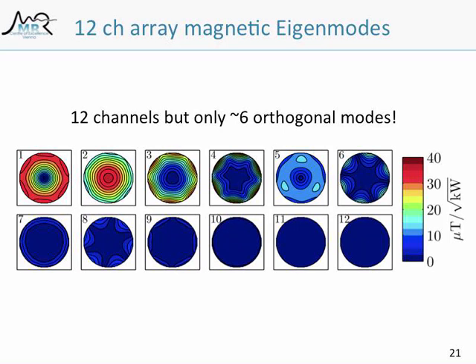But maybe this can be seen as something that gives a little bit of contribution, but really, that's just nothing. And again, we see we've got 12 channels, but it's really not that useful. And you wouldn't really see that when you just look at the single channel fields, because that just doesn't tell you that on that level.